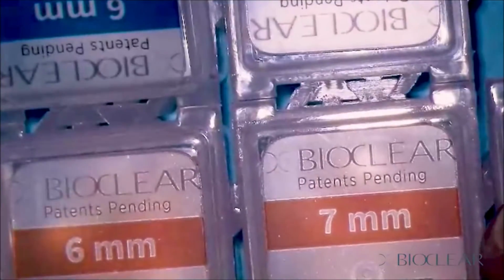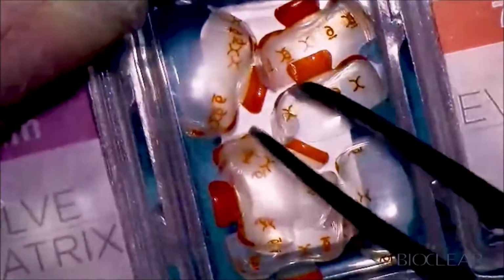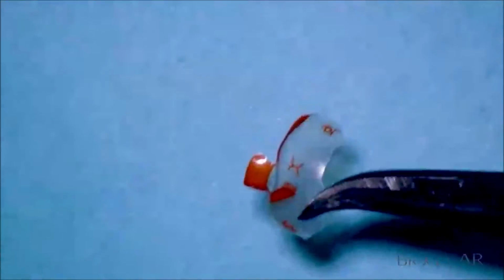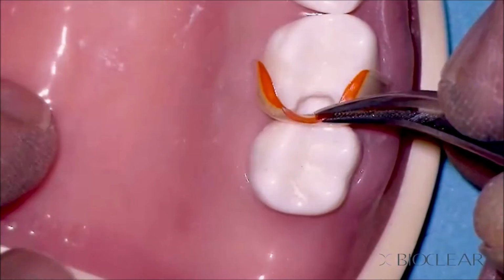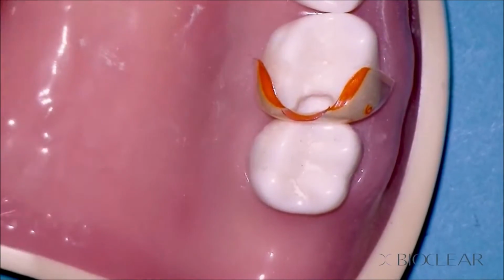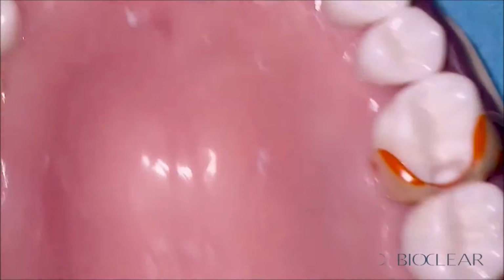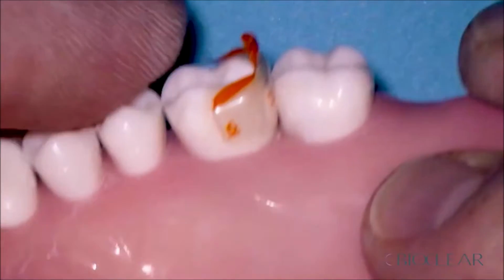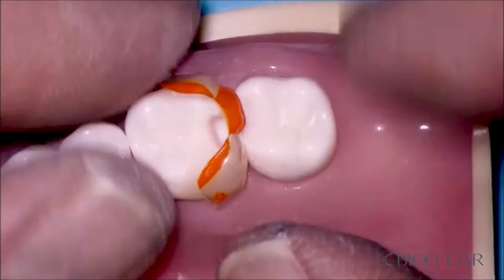So let's go ahead and grab a 6 millimeter orange Evolve because we gauge the cavity at 4 millimeters. I'll bring the 6 in here, and let's take a look how it fits in this shape. You know, it's really fun to have a recipe that works and is simple. I love doing class 2s now. I used to not really like them that much. So let's take a look at this. We're going to drive this matrix in, and you can see that that is a much better choice.